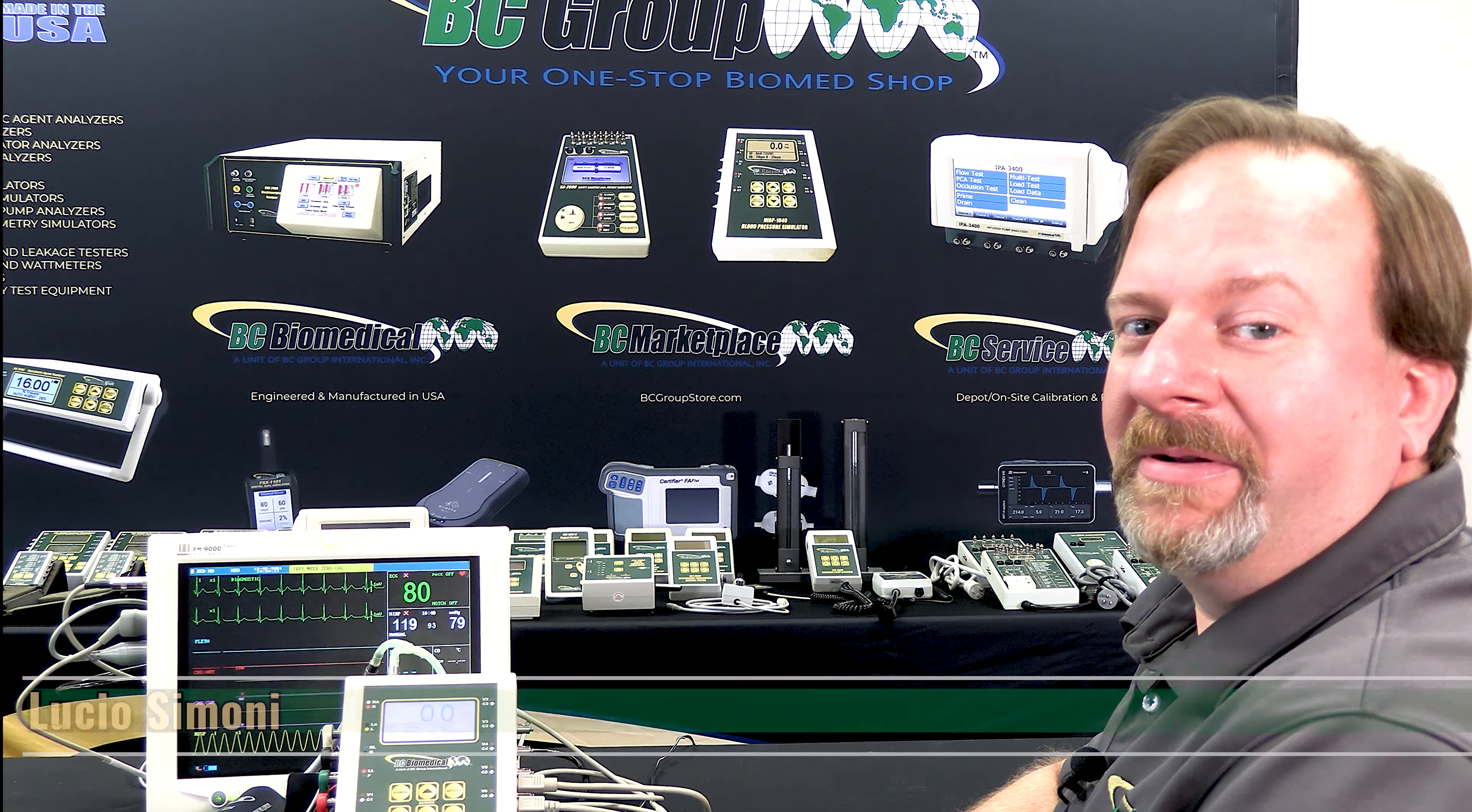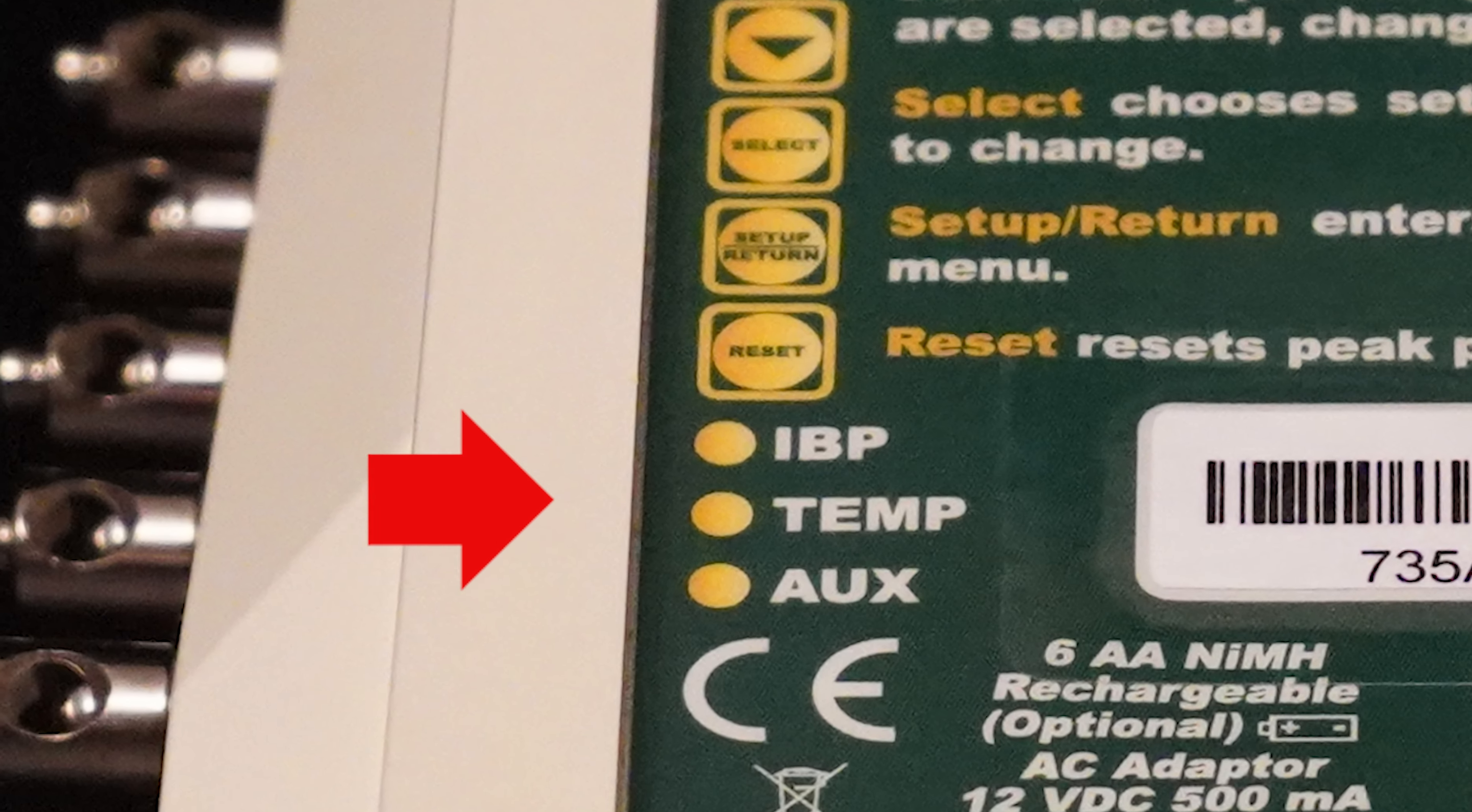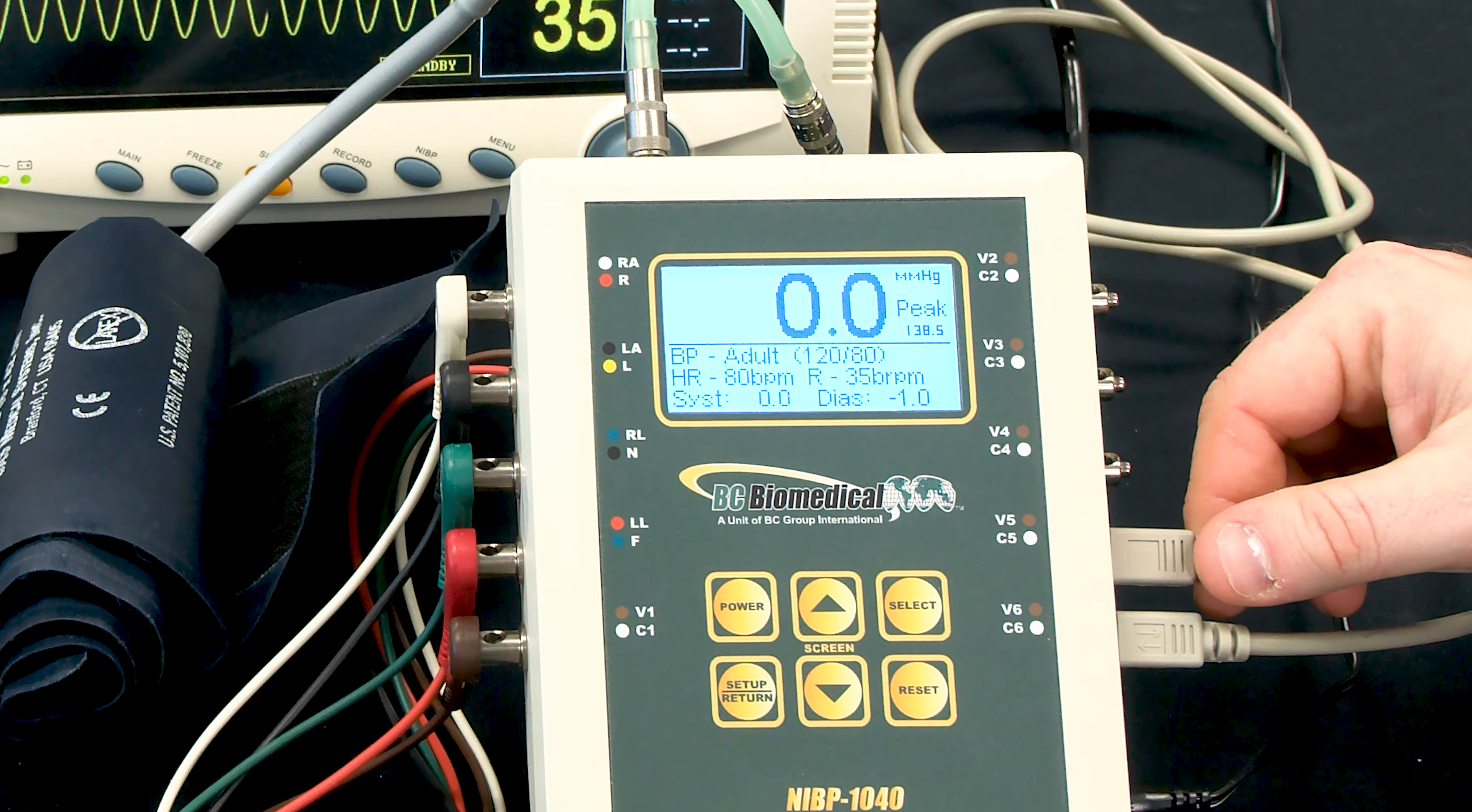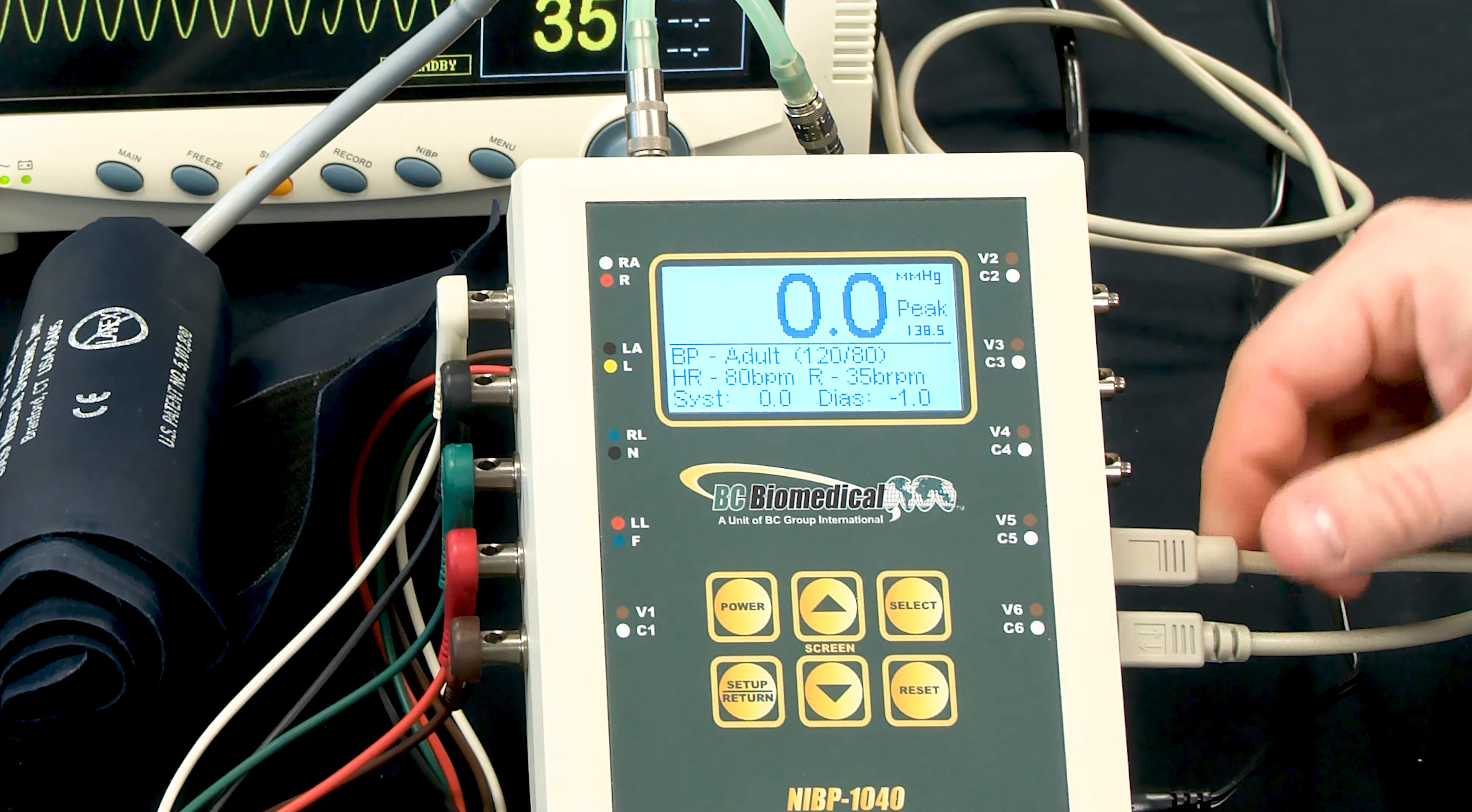In this case, I already have my IBP cable plugged in. On the back of the NABP simulator, we have a label that identifies the three ports. In this case, the top port is invasive blood pressure, and I have the cable plugged into my monitor. We can see that this line here in the middle is set for channel 1 invasive blood pressure, and it's not simulating anything. We need to figure out what's going on.